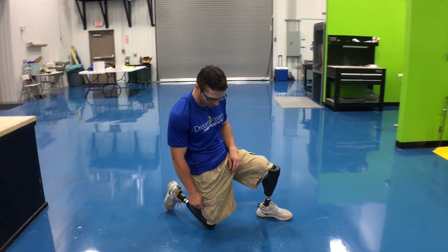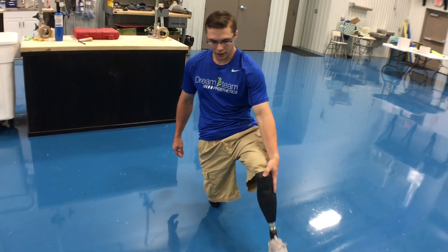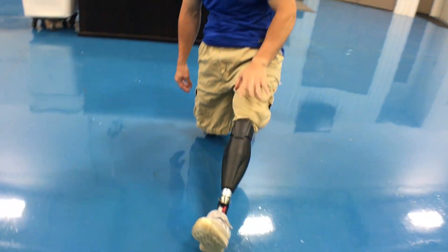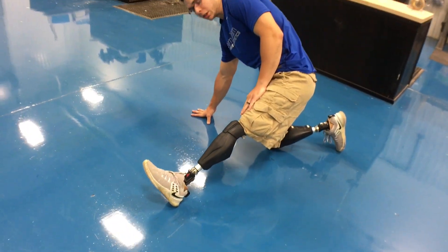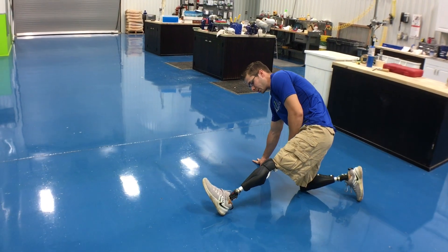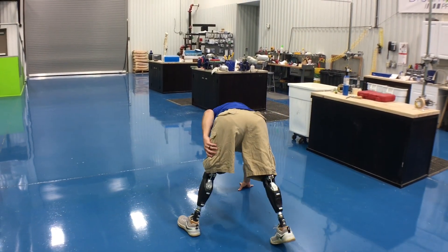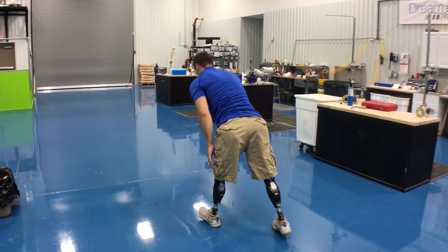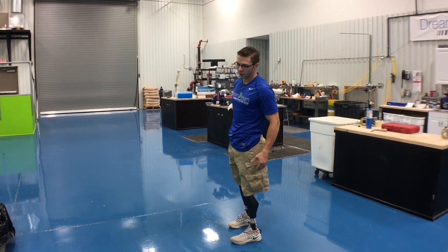To get up, I extend that left leg out to where it's kind of locked or hyperextended, put one arm down, and pull with my muscles in my left leg to get up like that. From there it's just standing up — you've got to fire up all your muscles to get up off the floor.